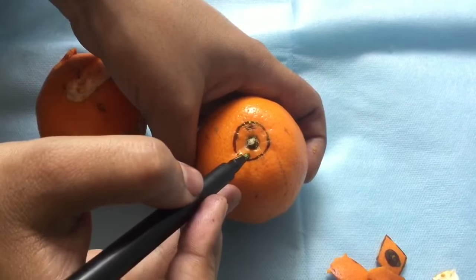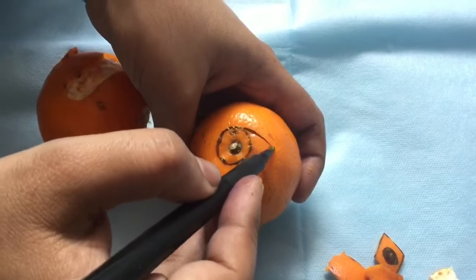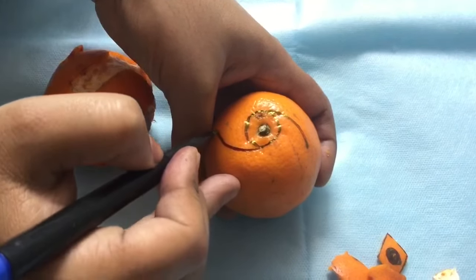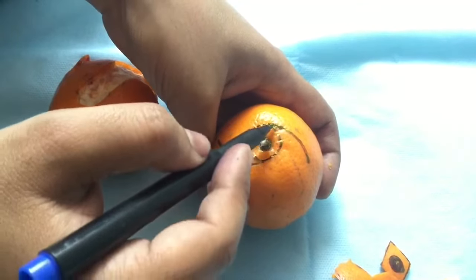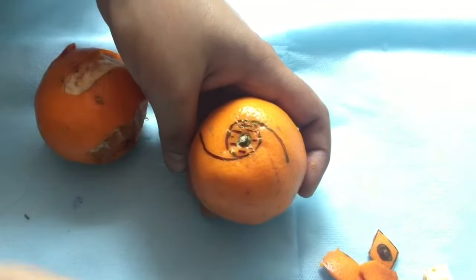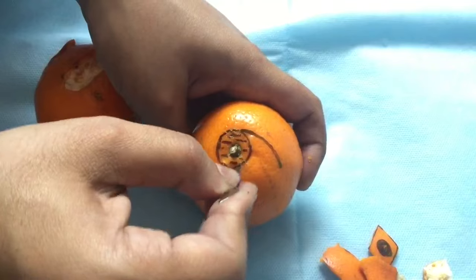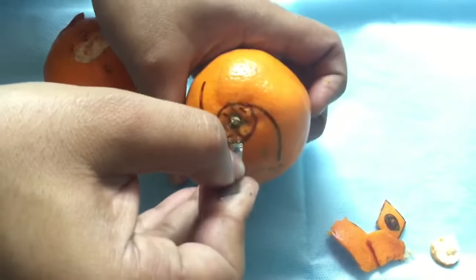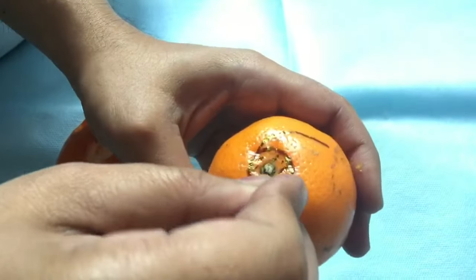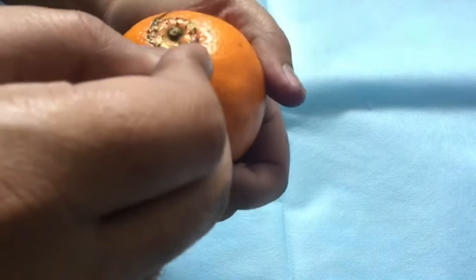This is called O-to-Z or S-shape flap. Suppose this is the defect — we put a curved incision there, then another incision comes in the opposite direction. This flap goes here, this comes here, and you get a straight-line closure. So let us excise this lesion and this is my S-shape extension. If I can't get good mobility I'll give a back cut.